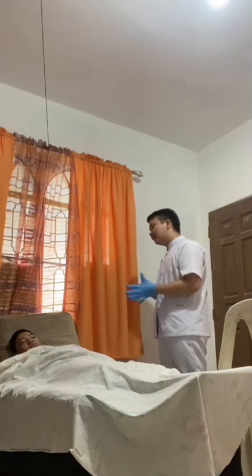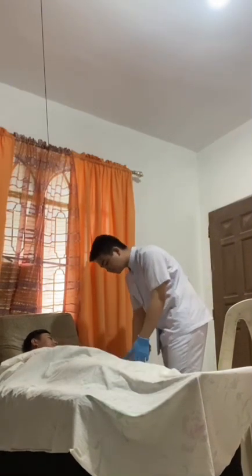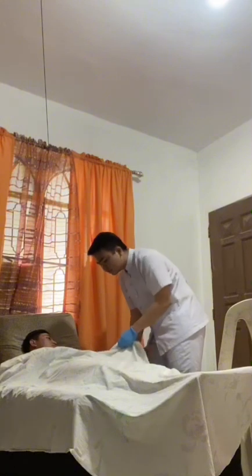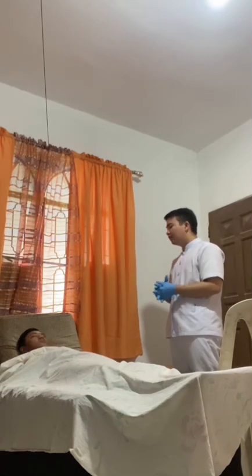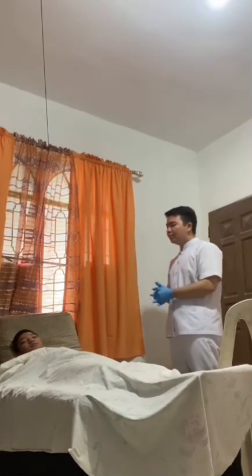Good morning, sir. I'm Dr. Vermusni, your student nurse. Can I check your wristband? Can you state your name, sir? And your date of birth? 2004, January 15. So, sir, I'm going to transfer you from bed to chair. The purpose of that is to promote blood flow, reduce bed sores, and promote comfort.